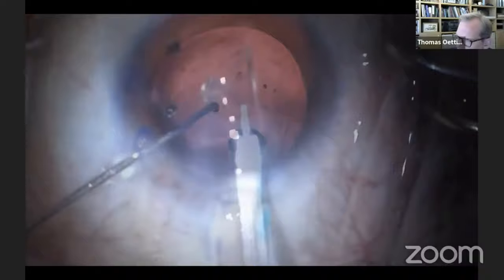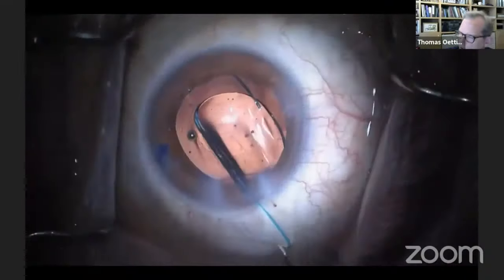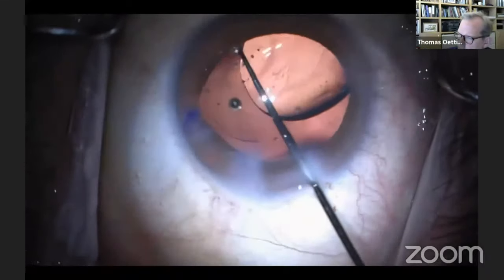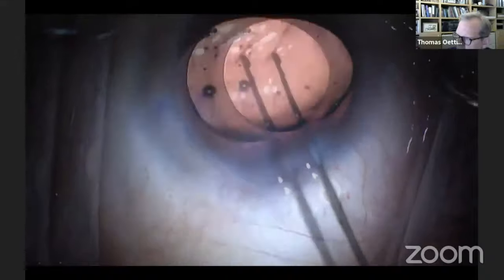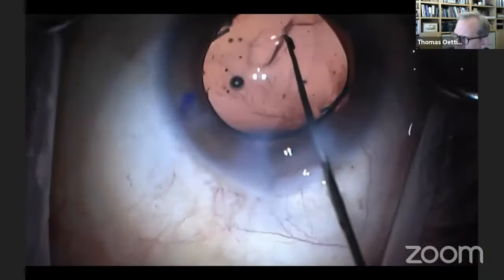And now we're able to place a lens in the sulcus. I just want to show you this lens here going into the sulcus. We're going to do this traditional optic capture where both of the haptics are in the sulcus, but we're going to place this optic into the bag. So you usually tuck half of it in, remove viscoelastic from below.